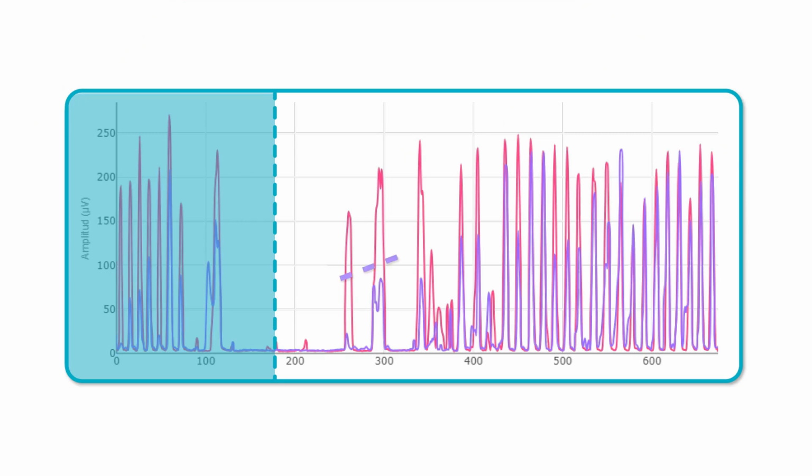The second strategy is to use biofeedback along with a detailed explanation. You will accompany the biofeedback with a more specific instruction. Try to place your whole foot down, including the heel, not just the midfoot, and aim to raise the purple line. In this case, look at the result. The patient is able to activate the right anterior tibialis more, correcting the execution of the squat and adjusting the motor pattern thanks to the visual information and your explanation.